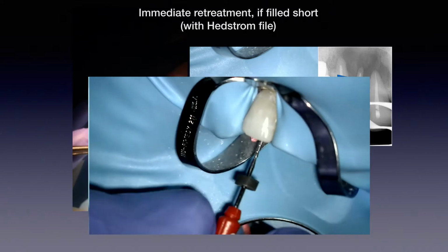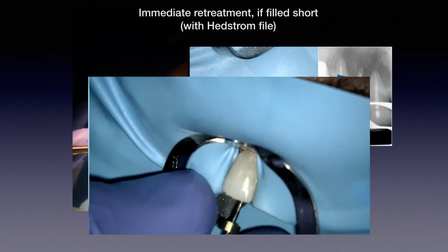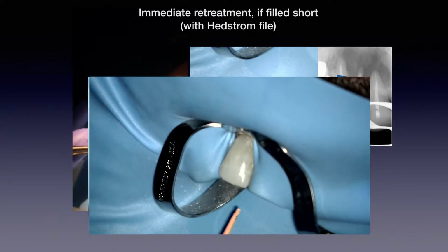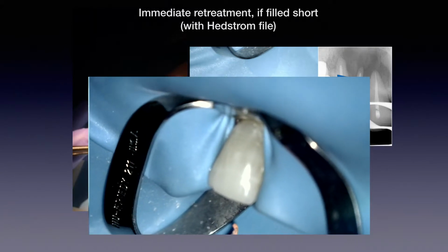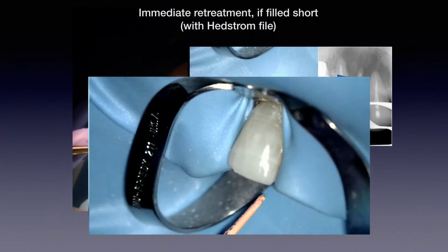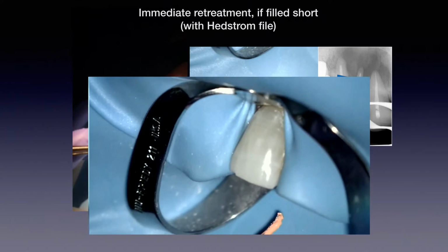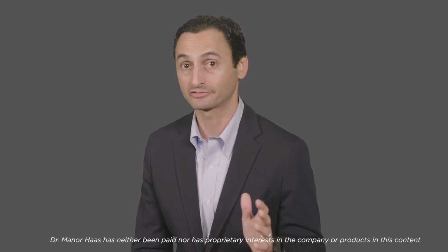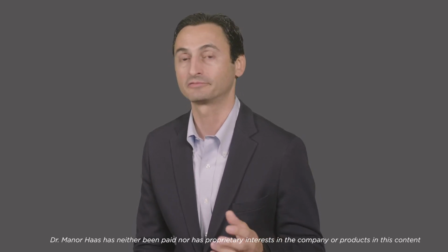Remember, the GuttaCore hasn't fully set. The sealer hasn't fully set. Grab this thing, pull it out, and I kid you not, this is all it takes. And look at that Guttapercha. It's come out all clean, and that's it. It's like an immediate, complete retreat. And you don't have to go back in there with your master file. You don't have to do anything. Maybe just coat a little bit more sealer in there and get right back to it. And whatever mistake you made initially, whether you were too slow or whatever it is, just make sure you do it right. That's all. But it's not the end of the world whatsoever.